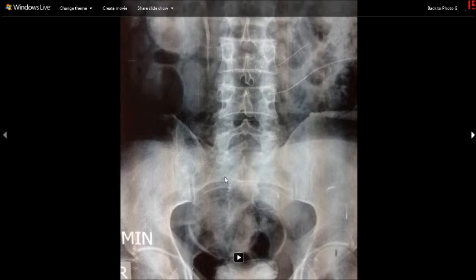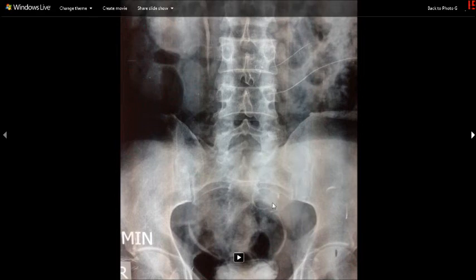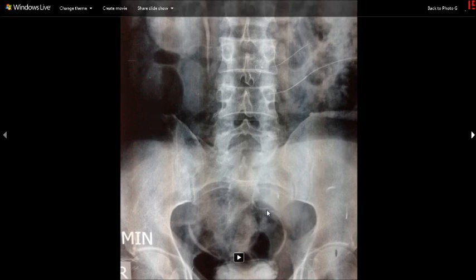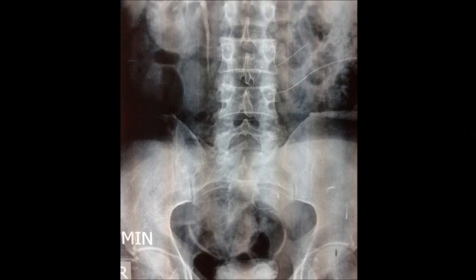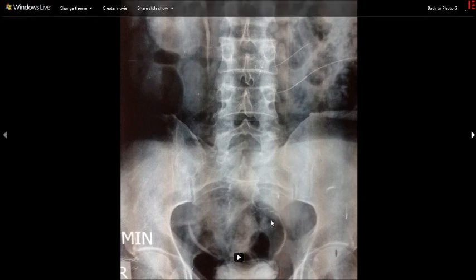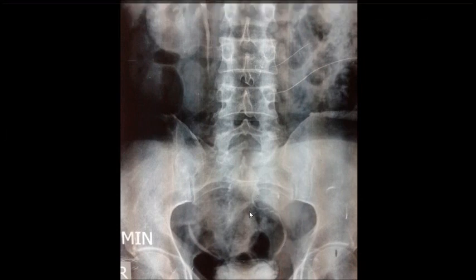You can see this mark, but we can't see anything on this side. This is the ureter ending up here. Here you can see a shadow overlapped by a bone — this is your ectopic left kidney, along with a tortuous ureter. Both kidneys were functioning, as you can see from the ureter very clearly.